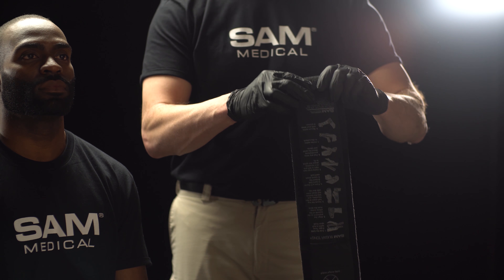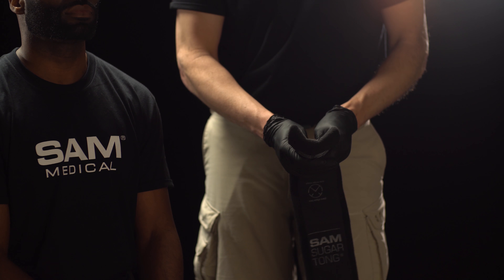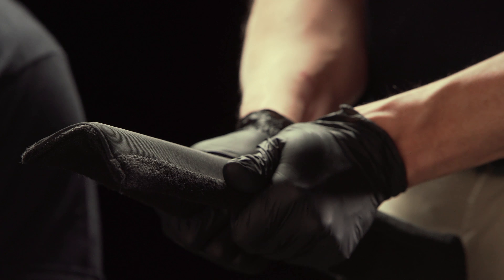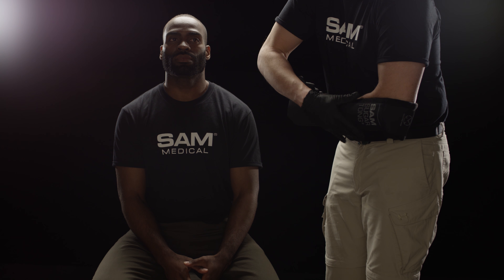Bend the excess to match the angle of the knuckles. Now form C-curves on each half of the measured Sam Sugar Tong Splint. Using your arm as the template, shape the Sam Sugar Tong Splint to fit tightly and mold to account for any bony protrusions or malformations.